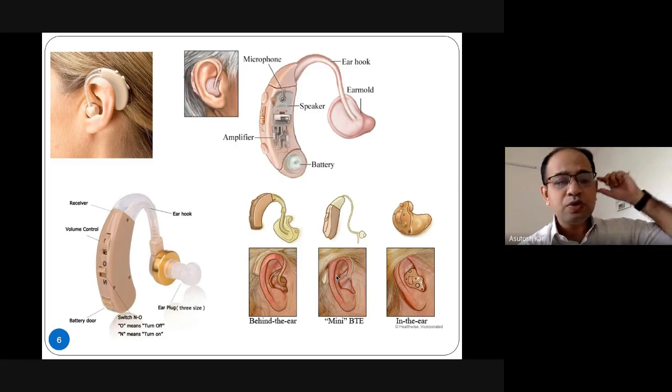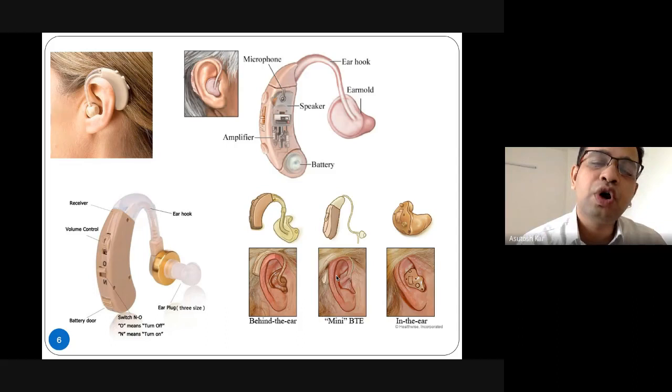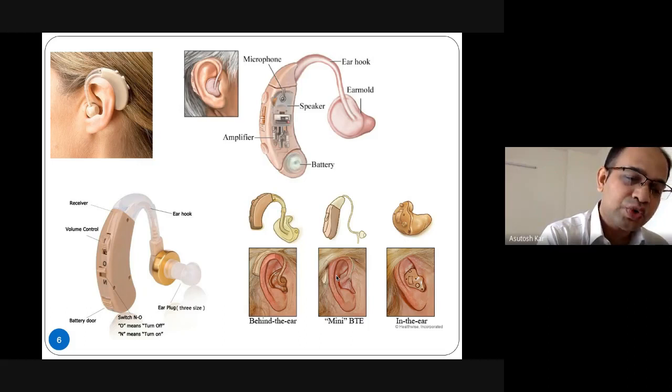Normally this low cost hearing aid, which various government and NGO agencies distribute free of cost, many people use it, and after a particular point in time, they hear an issue or problem of howling or feedback whistling. It provides a whistle sound, and after that these people throw the hearing aid. So therefore it is very important to study the signal processing behind the device, and being an engineer, our job is to optimize the signal processing so that the person using a hearing aid will use the device with all the advanced signal processing features and facilities, so that the entire experience will be better and the hearing rehabilitation will be better.